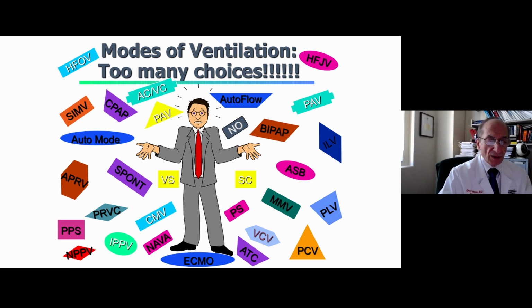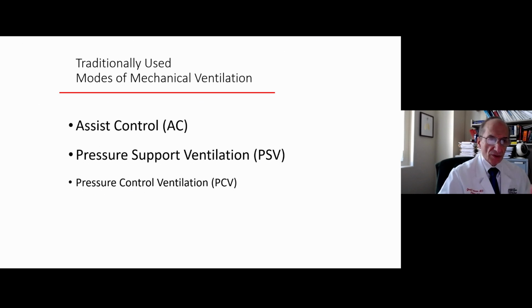Now, I want to disavow any notions that the actual mode of ventilation is that important. I know that people get very concerned about it. There are many, many modes of ventilation. Most of them are proprietary. They're almost all variants of the same thing. And I just want to make sure that you understand that there are really 3 modes of ventilation that are overwhelmingly used for the overwhelming number of patients.